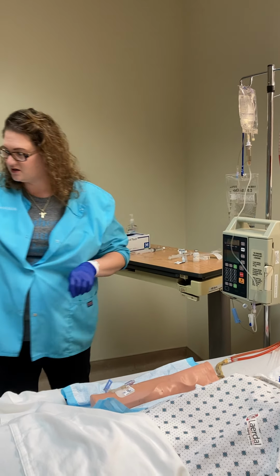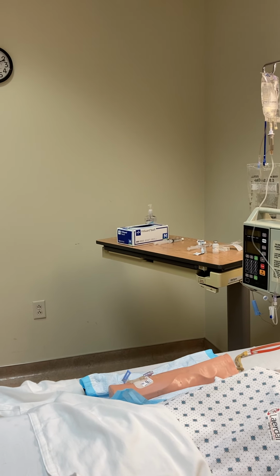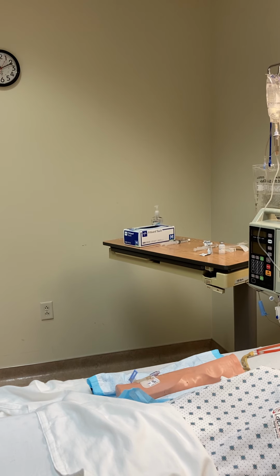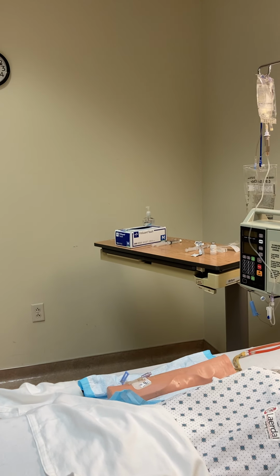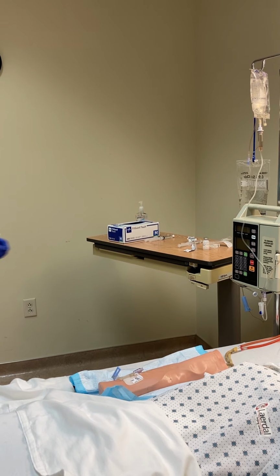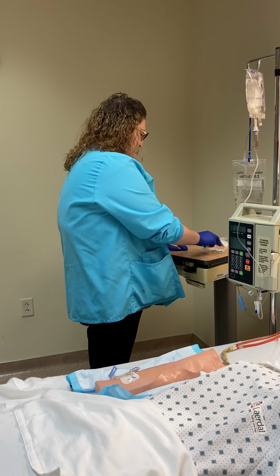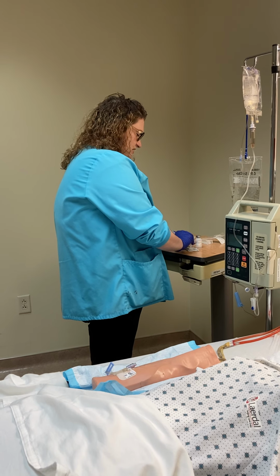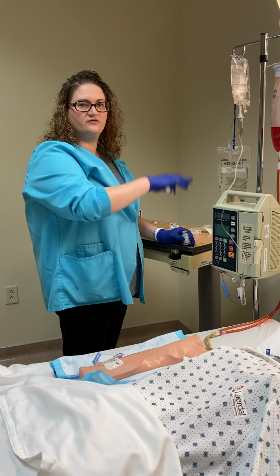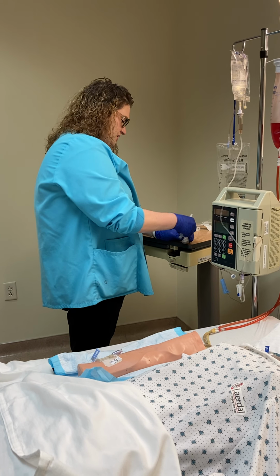and then doing IV push through the saline. Let's use our example again of the Zofran, except now he's off of his fluids. We're going to go through the J loop.